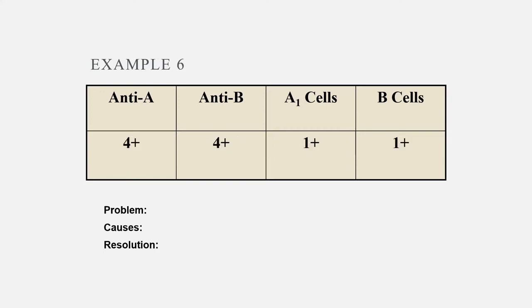Okay. Now, do we have extra or missing? Look at your strongest reactions. Now when you have extra reactions like this, there's a few different causes.